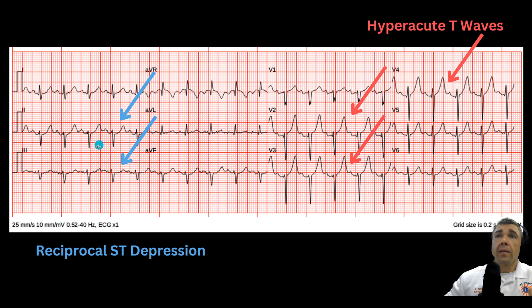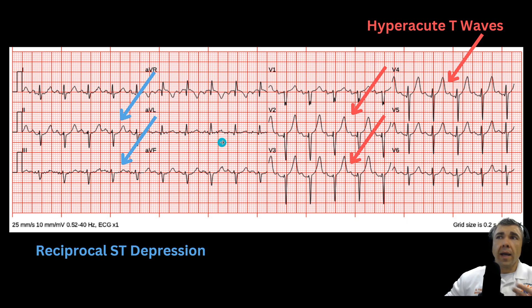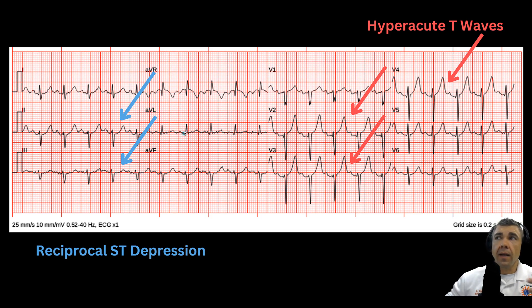The other way to know is if you start to develop reciprocal changes, such as ST depression. The anterior leads truly don't have reciprocal leads on a traditional 12-lead. The reciprocal changes you're seeing over in the inferior leads are likely an early indication of lateral wall extension — just like that 12-lead we were looking at that had an anteroseptal-lateral extension, this one will likely have that as well, and it did with the subsequent 12-lead.